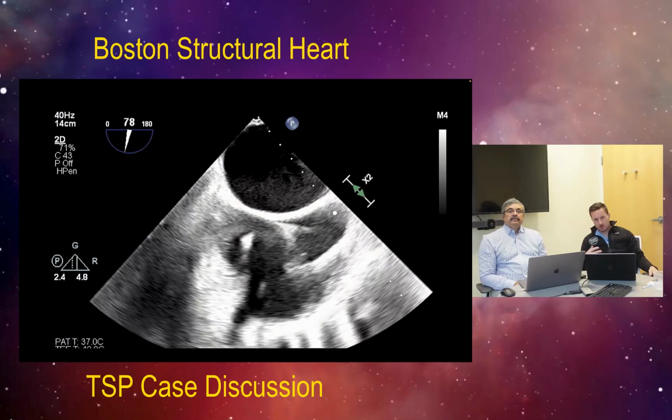Thank you very much, Feroz, for going through the PITLOC protocol. This is a very good protocol to follow when performing this complicated procedure. And just to piece all that together, we're going to go through a couple of images where we have performed a trans-septal puncture. This is a patient who had a previous left-sided procedure done. So as you'll see, they have a previous iatrogenic ASD. And our job was to perform this trans-septal puncture.